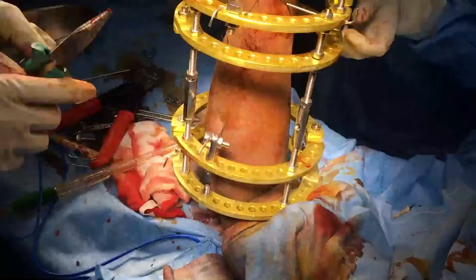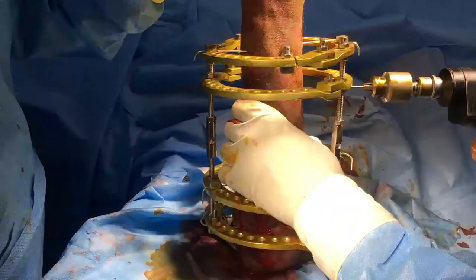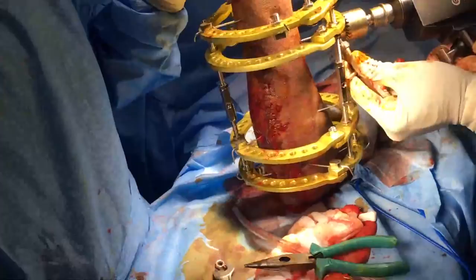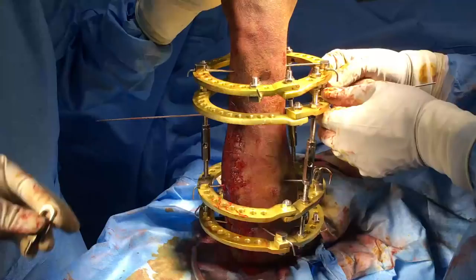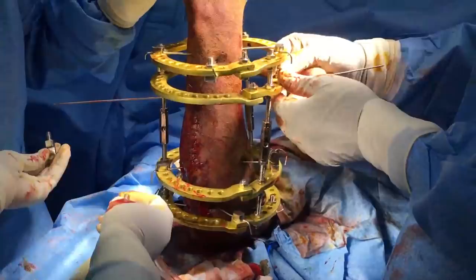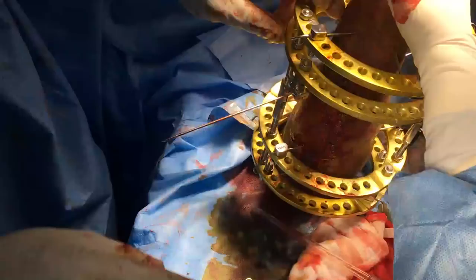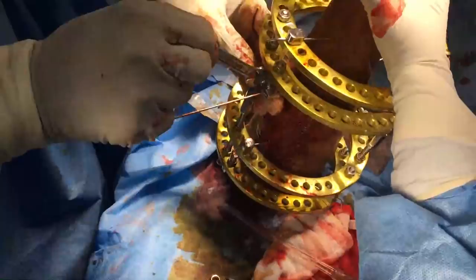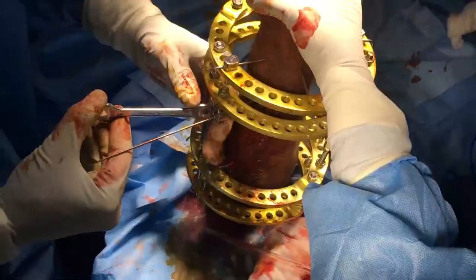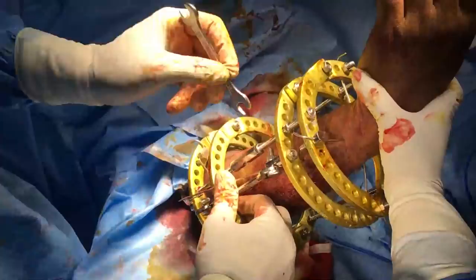We can see that a post has been used on this olive to allow traction. The next wire is an ulnar-radial wire from lateral to medial, and this again passes through the shafts of both radius and ulna. Because of the distances between the wire and the nuts, we occasionally have to employ washers or posts to ensure that the wires are not unduly stretched. The secret of a balanced frame is to have straight wires with no tension in the soft tissues.